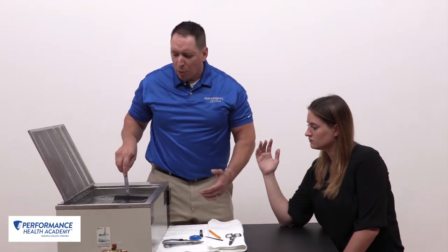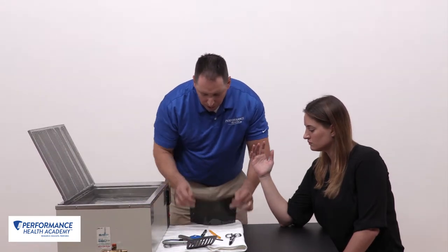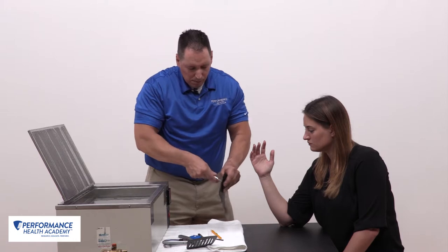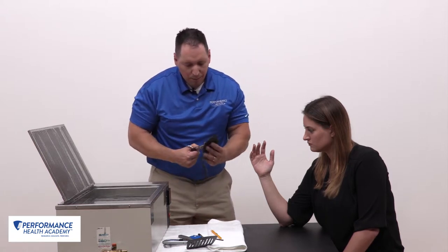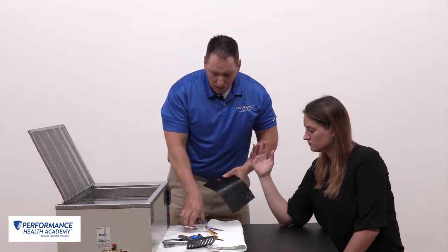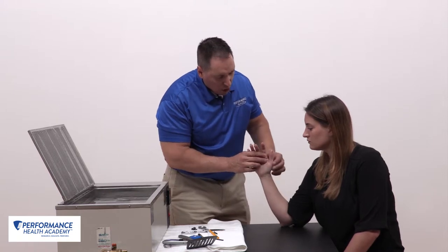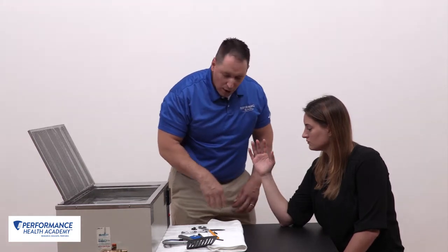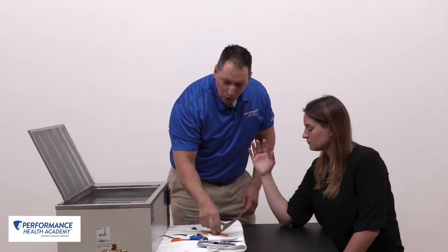This only takes about 30 seconds for this material to become malleable. I'll set up my thumb hole again, put that through the material, trim it off and create a thumb hole. This will go back in the water. I'll position my patient how I want them — whether wrist neutral or wrist extension — making sure they can oppose thumb to small finger. I'll place them in position, clean up my station, and have everything ready once the material is prepared.